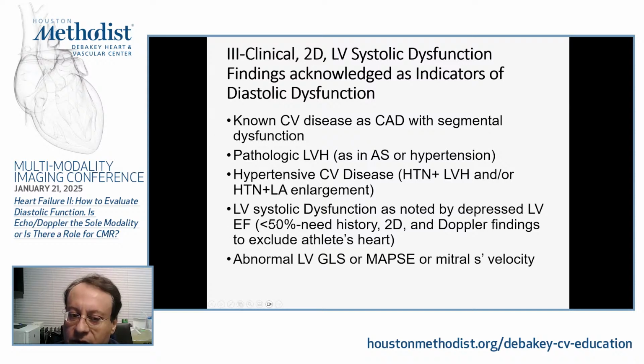Be very careful with ventricles with systolic dysfunction. We said there is an interaction between systolic and diastolic function. The caveat to the issue of systolic dysfunction and diastolic dysfunction in that setting is we want to make sure we are not looking at an athlete's heart, where you can see low normal EF or even high 40s ejection fraction, but it is nevertheless a normal heart. This is typically seen in athletes who do a lot of isotonic exercises. And the clue to that is you will see that other indices of diastolic function, such as the annular velocities, are normal.